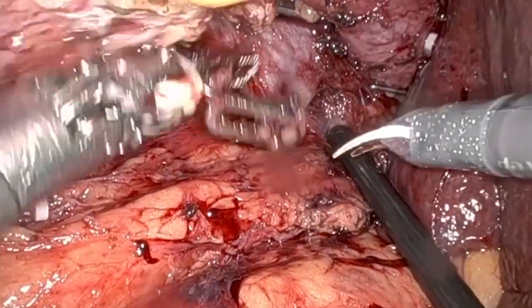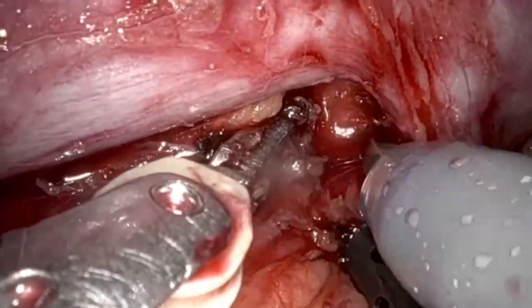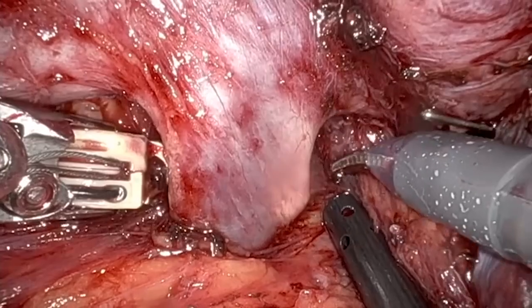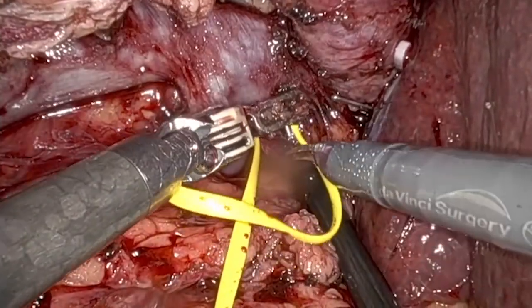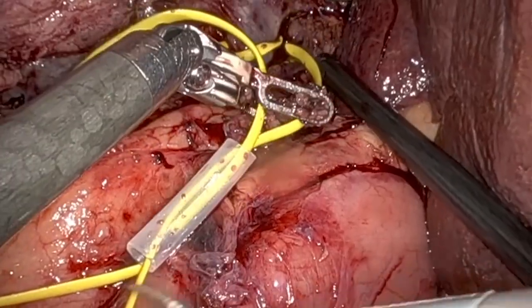After identification of the structures and their isolation, we proceed to the placement of basal loops for clamping, which is carried out using the Rommel tourniquet technique. The contralateral renal vein was isolated, as well as the distal and proximal vein, confirming with ultrasound that the thrombus has been included in the clamped section.